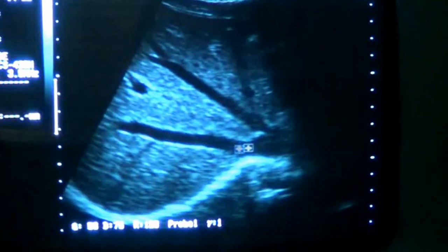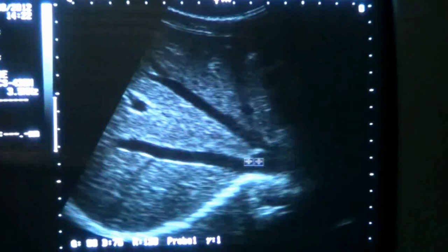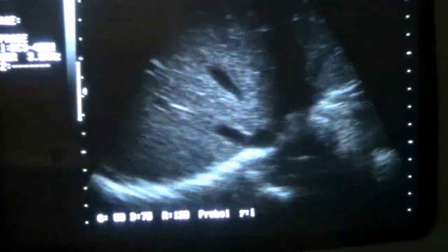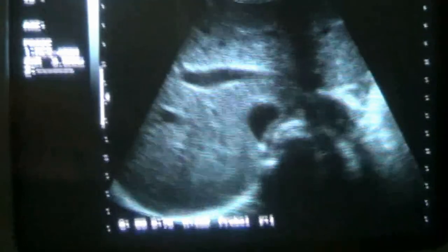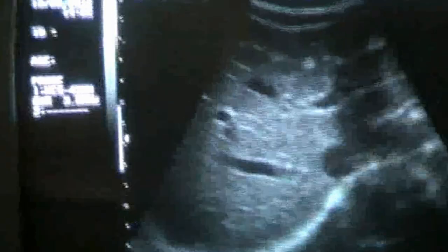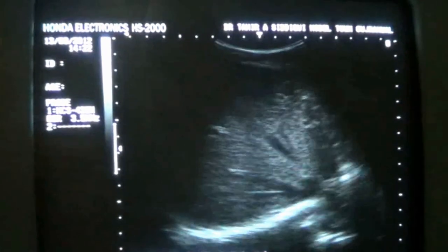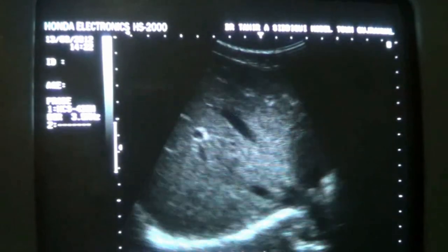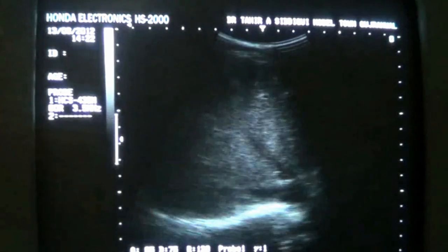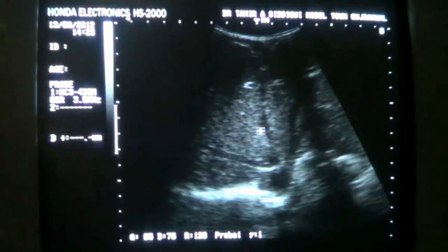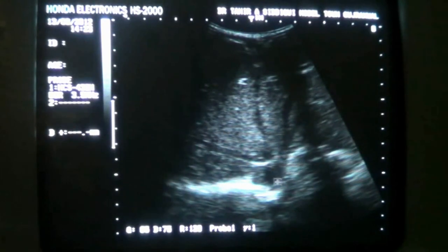This is the right hepatic vein entering the IVC, middle hepatic vein entering the IVC. Now I angle the probe a bit towards the head of the patient to get the left hepatic vein as well. So here I am getting two and now this is the left hepatic vein. Middle, right.